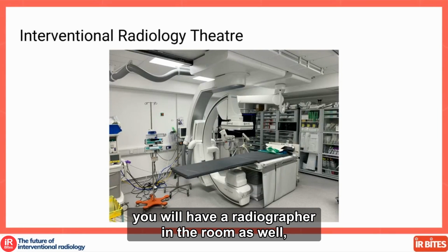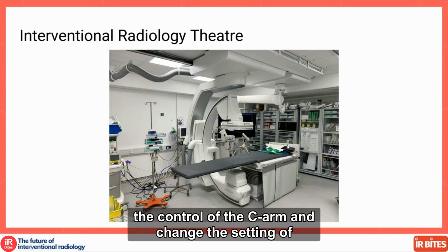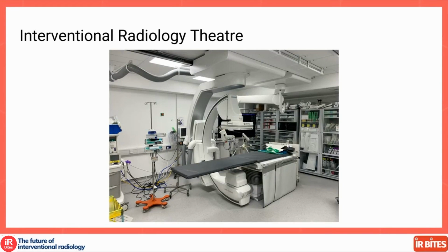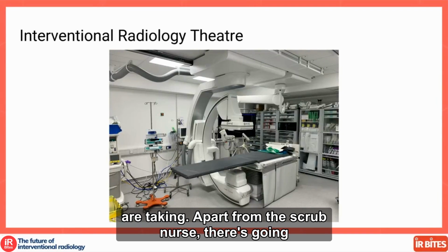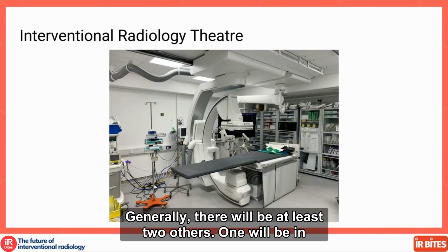You will have a radiographer in the room as well, and they would be the ones dealing with the control of the C-arm and changing the settings of the X-rays to optimize the image that you are taking. Apart from the scrub nurse, there are going to be other IR nurses in the room as well. Generally, there will be at least two others.